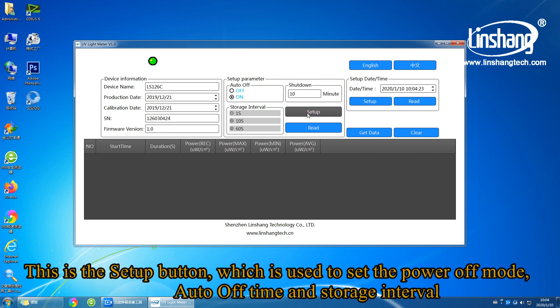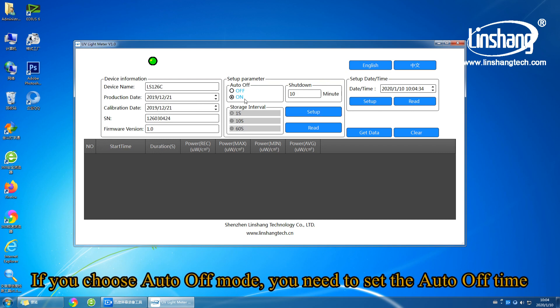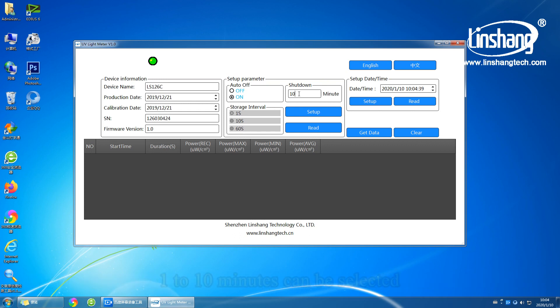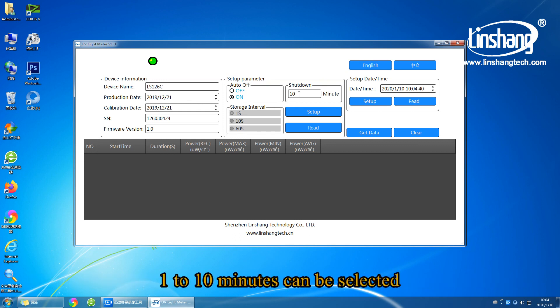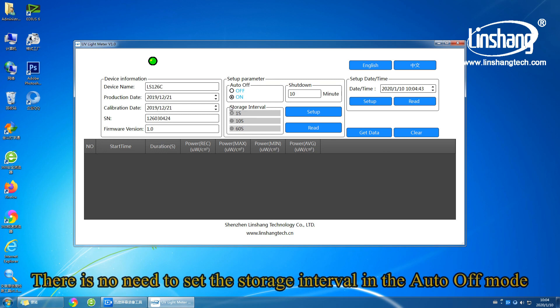This is the setup button, which is used to set the power off mode, auto off time, and storage interval. If you choose auto off mode, you need to set the auto off time — 1 to 10 minutes can be selected. There is no need to set the storage interval in auto off mode.